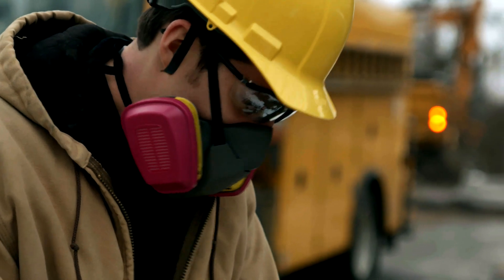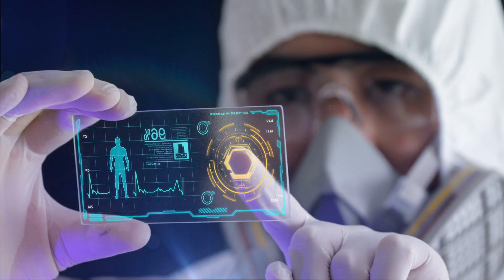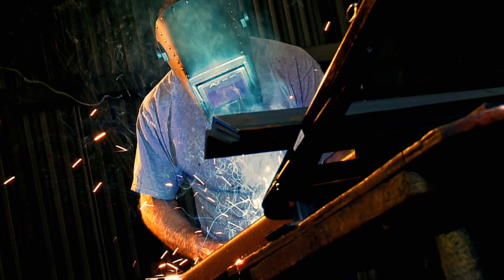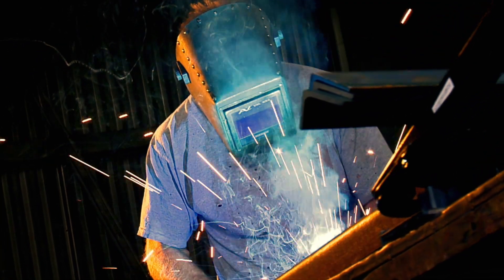The AccuFit 9000 uses proven CNC particle counting technology to conduct tests using ANSI, OSHA, or CSA testing protocols to deliver the fastest, most versatile fit testing experience available.